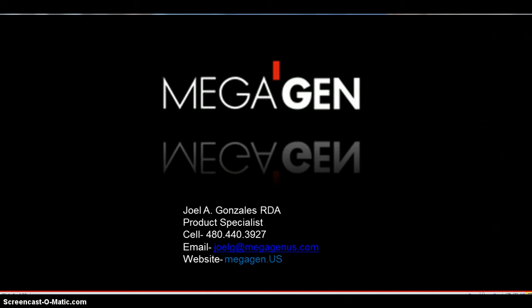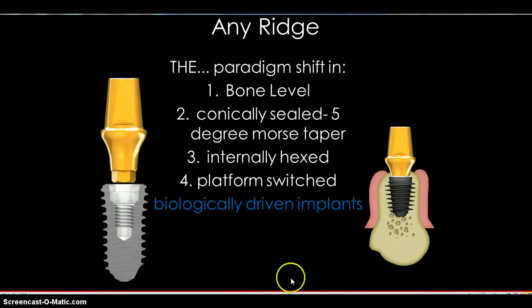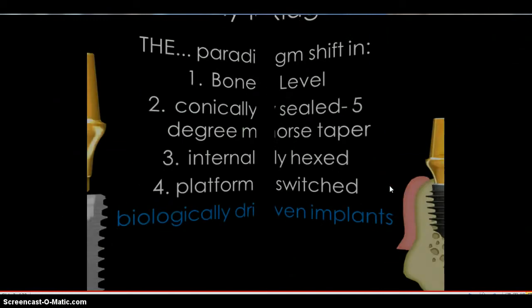In this video, we will be reviewing the AnyRidge restorative process, however with a slight review of the surgical process itself. Now, just as a review on the AnyRidge system, it is a bone level implant, which means surface roughness to the top. It has a 5-degree Morse taper built into the implant, which we'll be going over in just a second. It has a deep internal hex connection combined with the 5-degree Morse taper. And it is platform switch with all the prosthetics relative to the final prosthetics themselves. So again, we're going to be reviewing that in just a second.